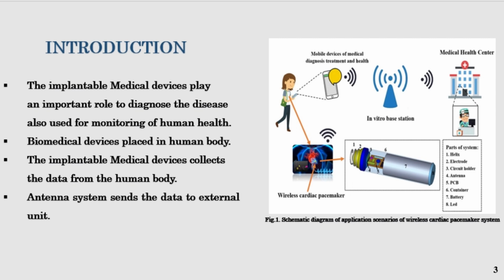The implantable medical devices collect the data from the human body. The antenna system sends the data to an external unit, and biomedical antennas operate within the human body, which serves as a dissipative transmission channel, unlike antennas operating in free space.